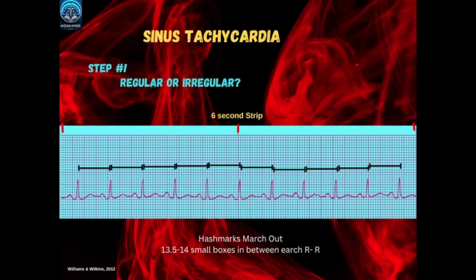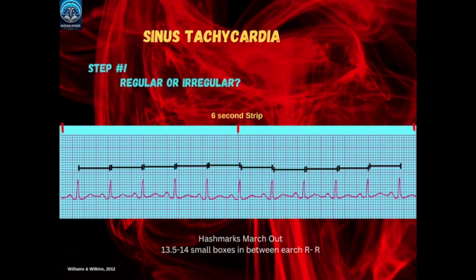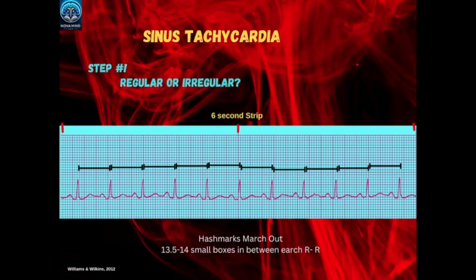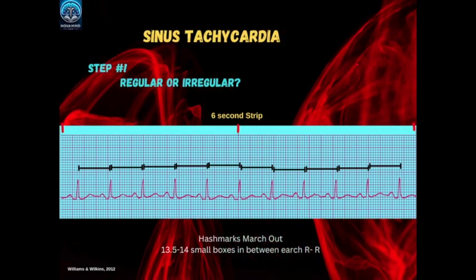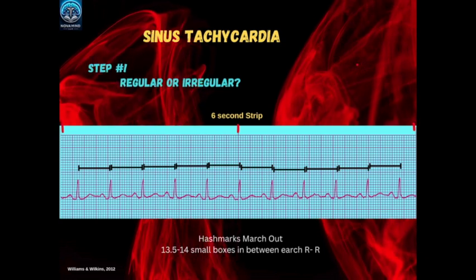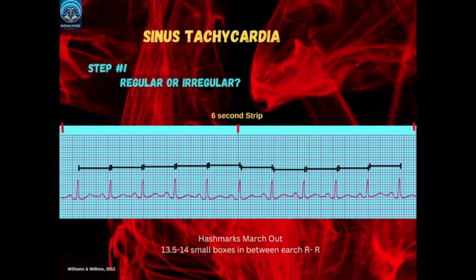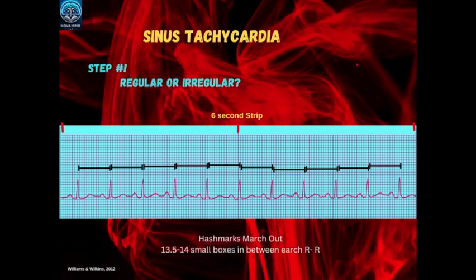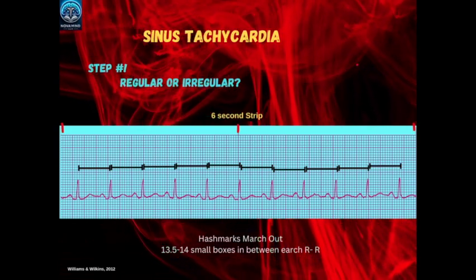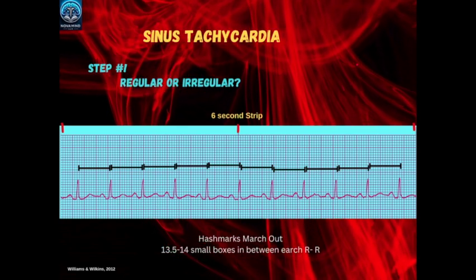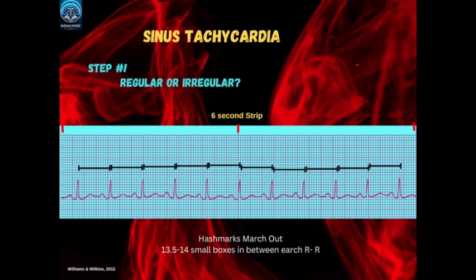Let's do a practice strip. To interpret sinus tachycardia on an ECG strip, our first step is always to determine whether the rhythm is regular or irregular. The key is the R-to-R interval — the time between two consecutive R waves representing ventricular depolarization. In sinus tachycardia, these R-to-R intervals should remain consistent. You can check regularity by marking the distance between two R waves using paper or calipers and moving across the strip. Slight variations of up to one to two small boxes are considered normal; variations exceeding two small boxes indicate an irregular rhythm. In this example, the R-to-R intervals are approximately 14 small boxes apart, confirming a regular rhythm consistent with sinus tachycardia.